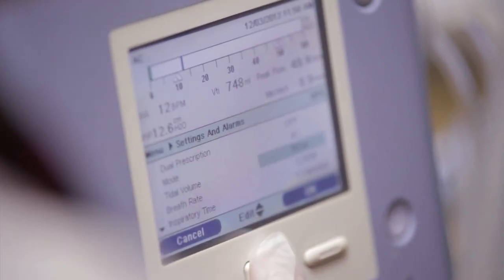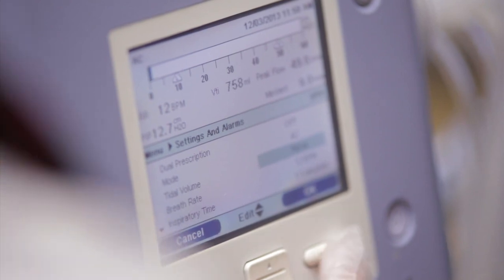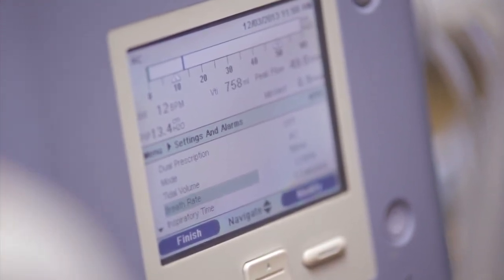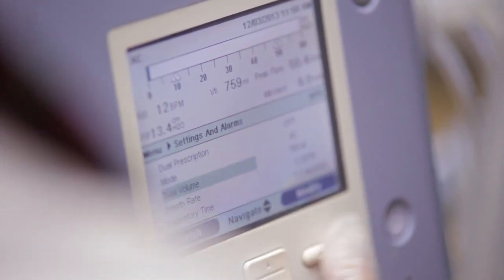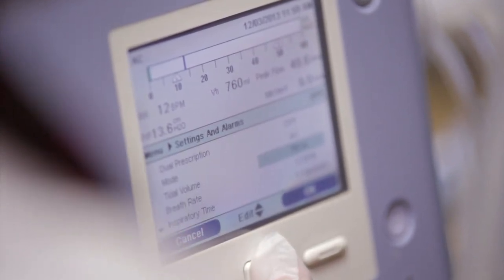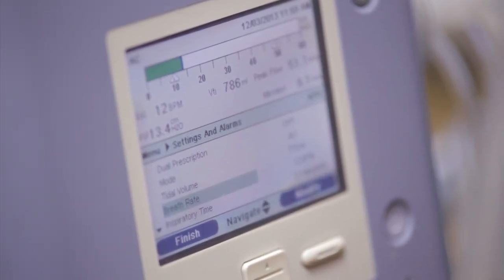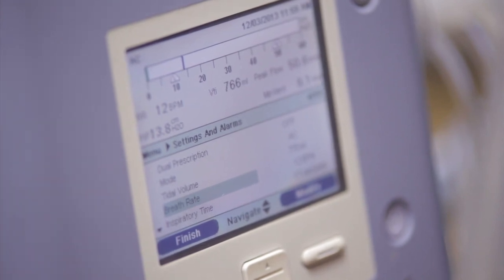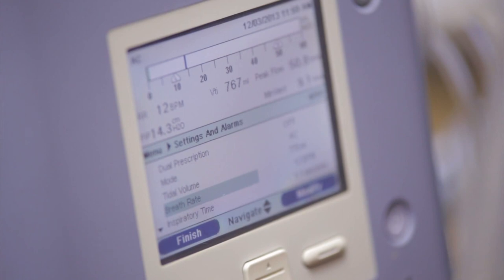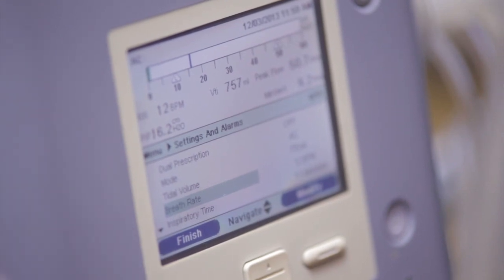So I go in here and modify it — I'm going to increase by 5, then by 10 to see how that is. Your PIP just went up 1.4, now at 13.2 to 13.4 — we're not quite there, so I'm going to modify it a little more. I'll increase it by 10 again and see how this does. We're still always going to have that leak, so sometimes it varies. We're getting to around 15.8 and 14.3 on your inspiratory pressure — getting closer. There's 16.2, maybe we're there.